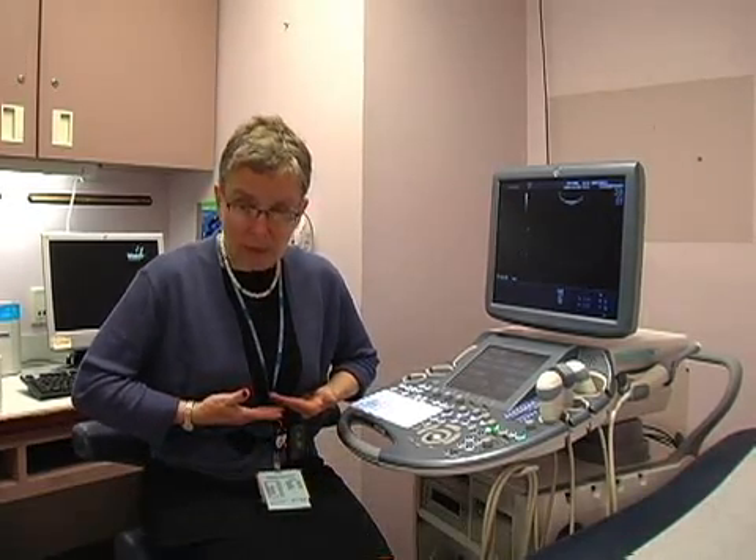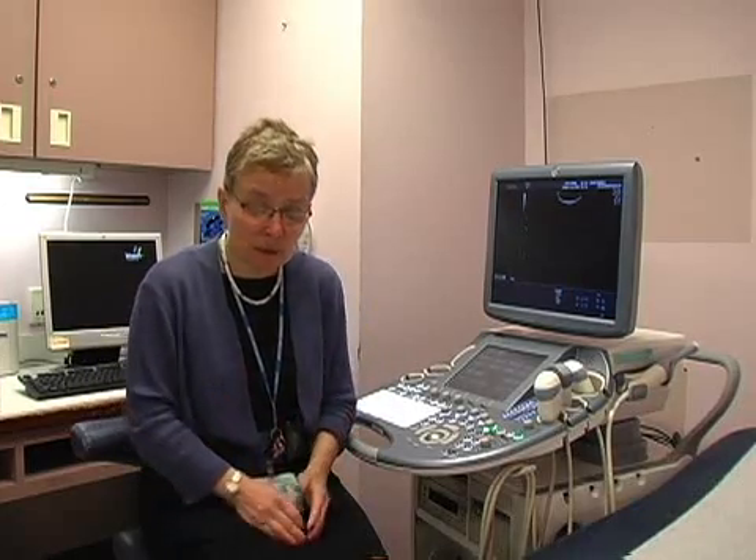When exposing a patient to be scanned, it's important to pay attention to the patient's privacy. In general, we lay the patient flat, and the area below the pubic bone is covered with a towel or a sheet before pulling the patient's top up. The top is then pulled up to approximately the level of the ribs so the entire abdomen can be exposed for scanning.